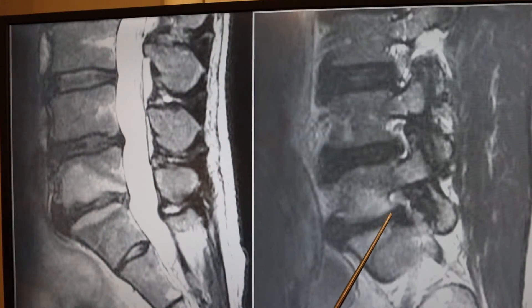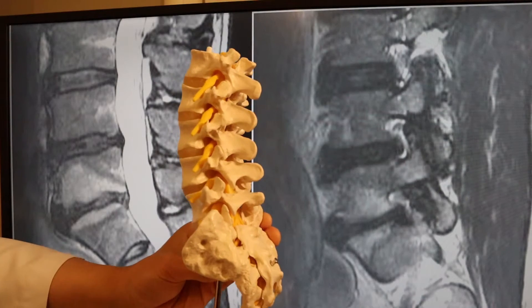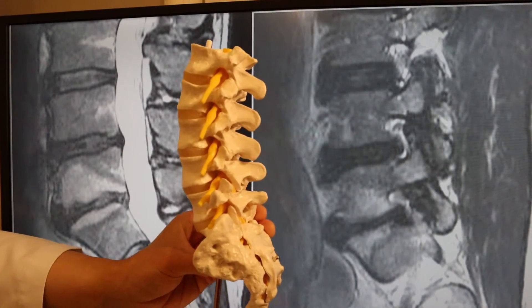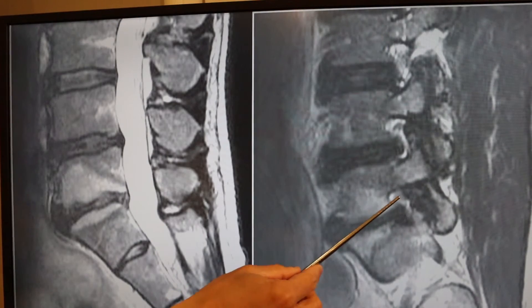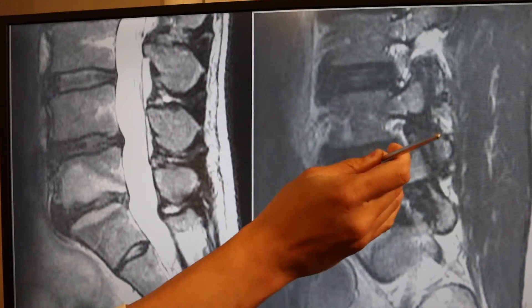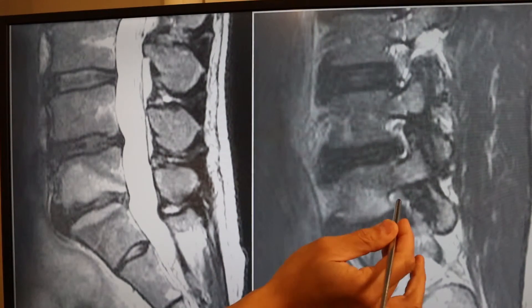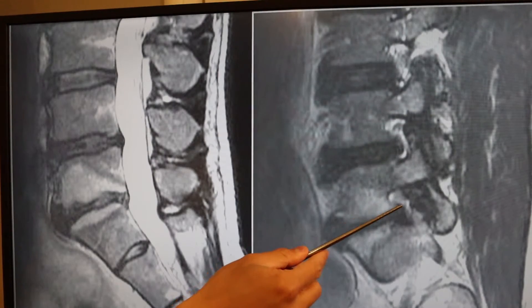Here's a look at the same patient's foramen in a parasagittal view, which is a side view. You can see bone, disc, bone, and a nerve coming out. Here's a normal nerve with fluid around it. And here's the nerve at L5-S1 — because of the compression, you're getting up-down compression of this nerve. Another fairly common complaint of patients with degenerative disc disease is a pinched L5 nerve, which presents as sciatica.